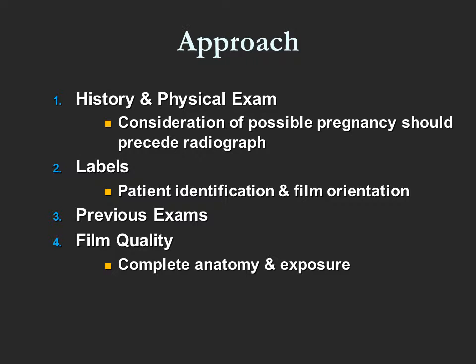There are several steps in the basic approach to abdominal X-rays. First, a proper history and physical must be done prior to radiographic study. In addition, the possibility of pregnancy in women of childbearing age should be determined prior to obtaining an X-ray to avoid unnecessary radiation to a fetus.